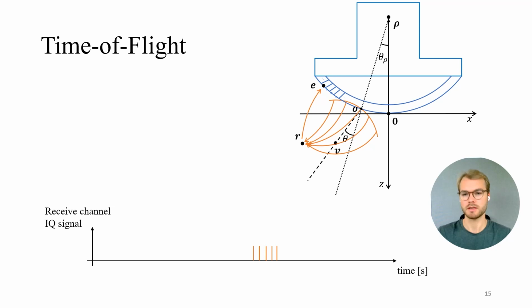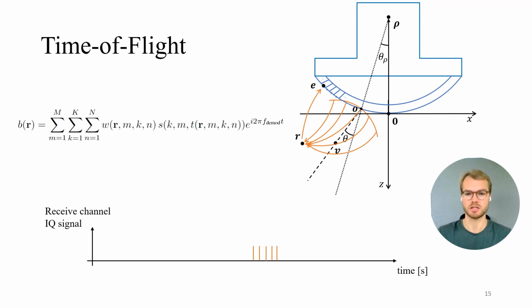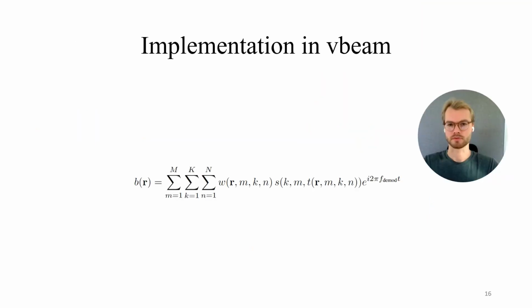The pixel-based beamformer with REFoCUS and spatial weighting is captured in this equation, which is a coherent compounding of n sender elements, k transmit events, and m receiver elements. We note here that the weighting function W is a function of pixel position, receiver element, transmit event, and sender element. The time domain pixel-based beamformer is implemented using the weighting function mentioned.